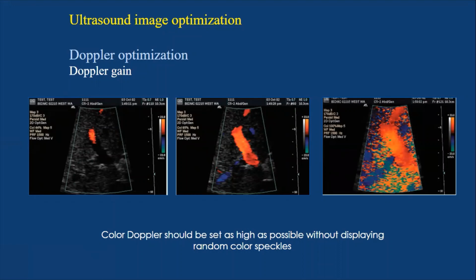But generally, as a whole, if you want to do things manually, for color Doppler gain, usually start with increasing the color gain to the maximum until we see the noise outside the vessel. Then we will decrease and decrease until we get the filling of the flow inside the lumen, just below the color bleed. Color bleed means the presence of color signal outside the true vessel.